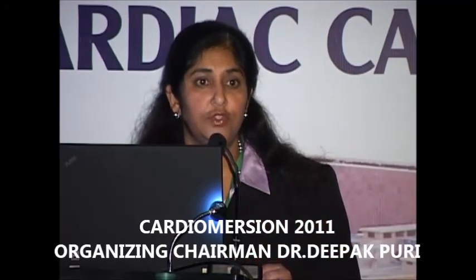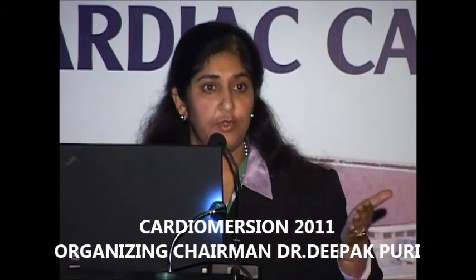In fact, we try to do a kind of altered triple rule out for every patient who comes with acute chest pain. The basis of that was pretty much your scenario, and that's what we have resolved to. And now we have tried, in a couple of cases, dual energy CT, where we have been able to generate pre-contrast images from the direct contrast CT, which is very useful.